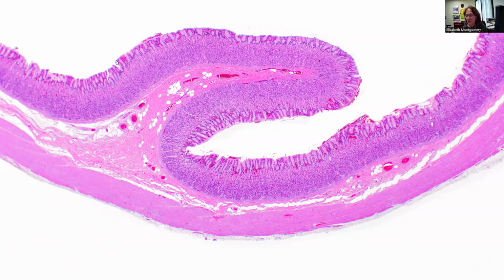This is just an oxyntic stomach. And just to remind ourselves, this is oxyntic mucosa. The chief cells are down below. And here's our submucosa. The vessels start to get bigger here. This is when metastases get easier, even though you can have them from lamina propria. And here's our muscularis propria.